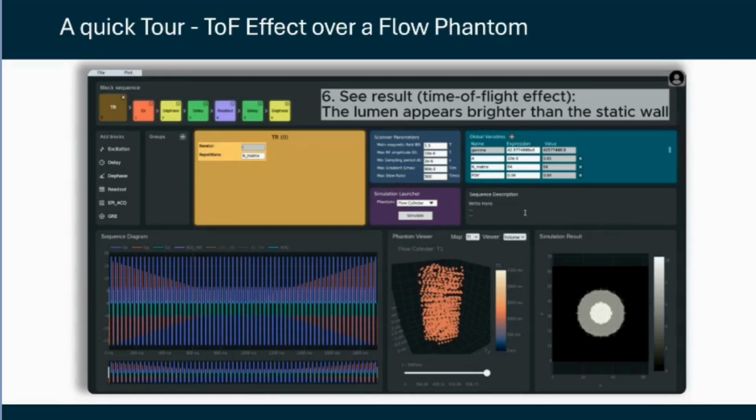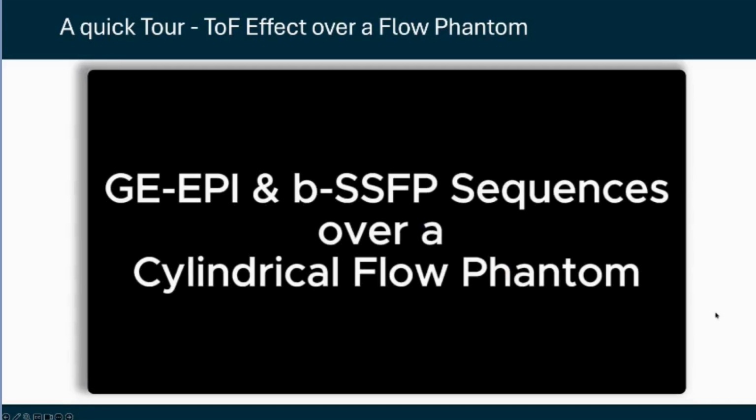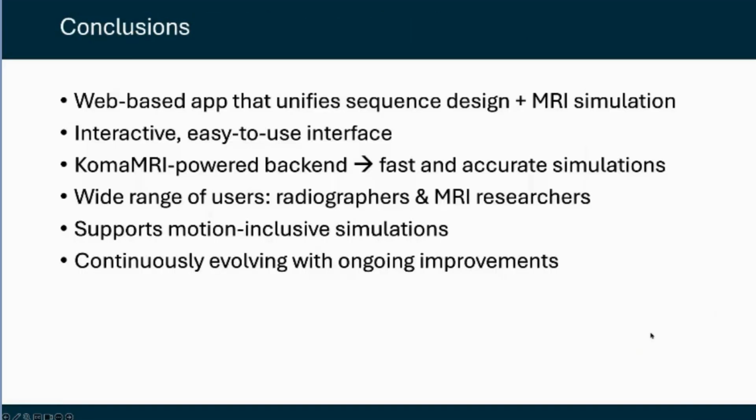So this opens a lot of possibilities to maybe recreate more complex experiments, or just to develop and prototype sequences. So let's continue with the conclusions.